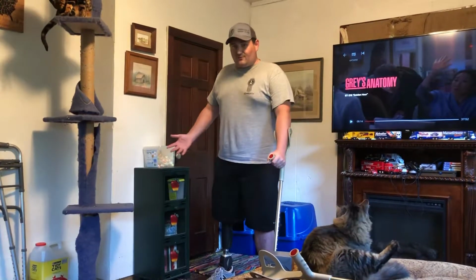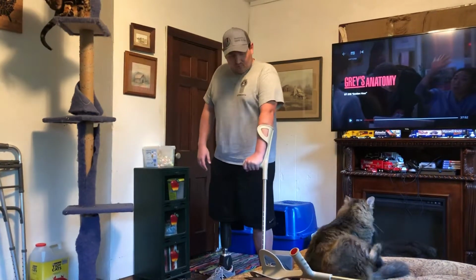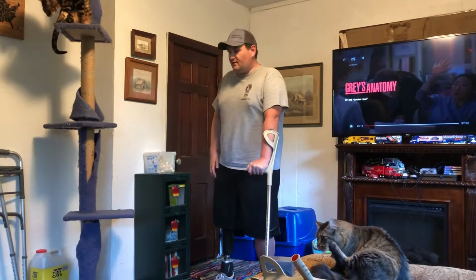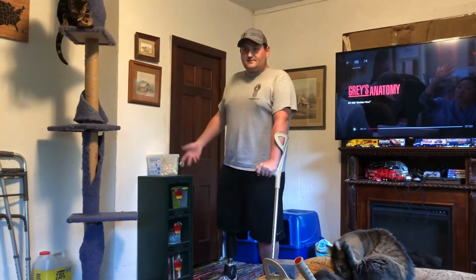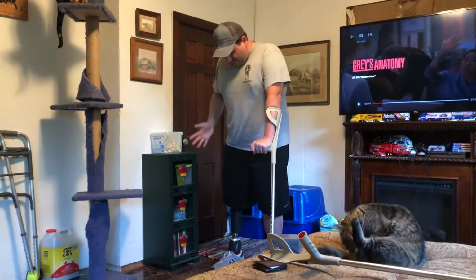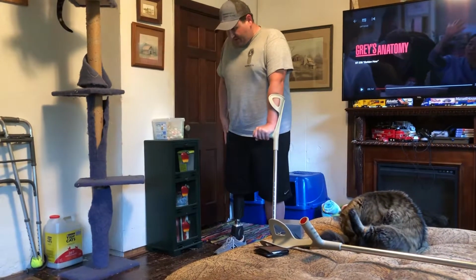When I'm on flat, level ground, like in the house, I only use one. Any other time I keep two on me, I try not to use the other one, just so I can slowly transition completely off of them. But I'll do a little bit of walking here. This is not very perfect.